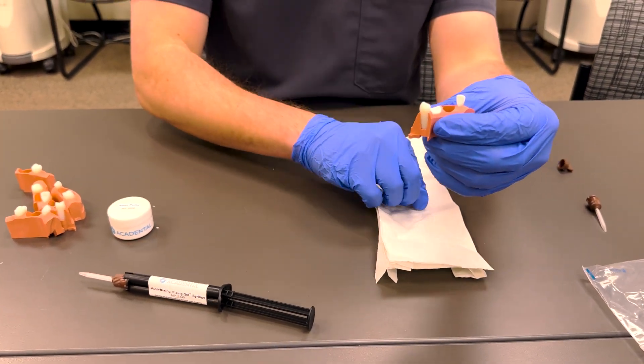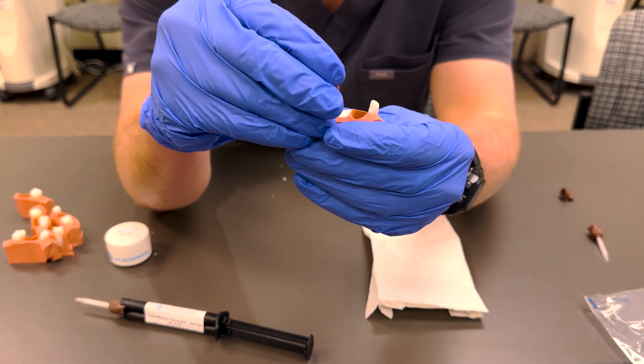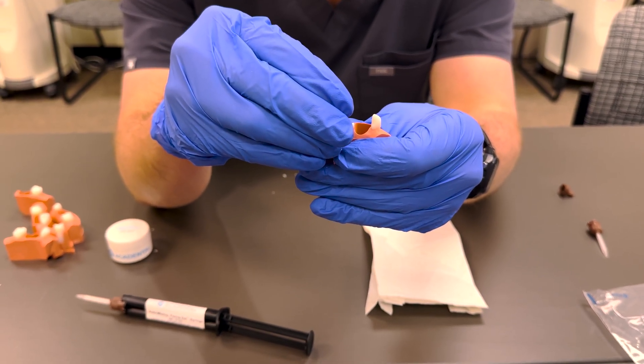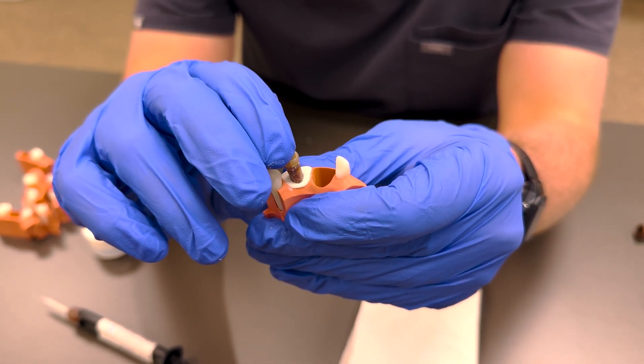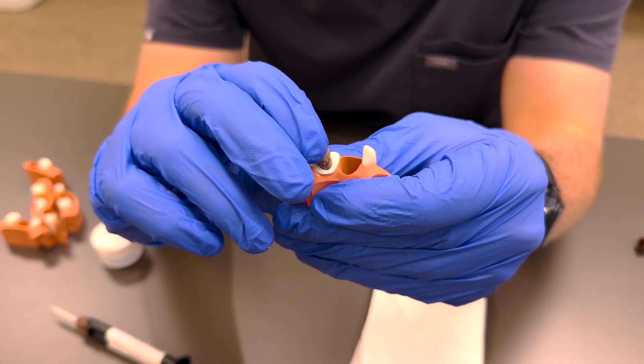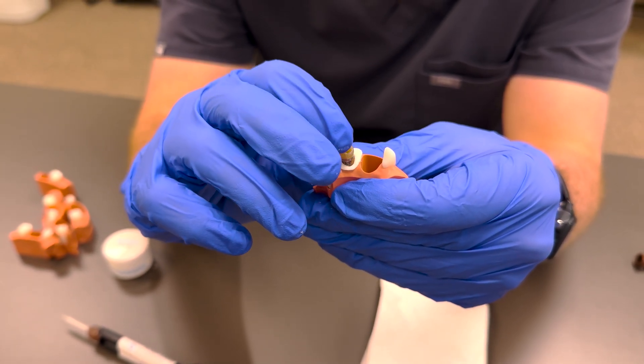From here, you're going to take your extracted tooth and place it into the apex putty. Try to center it a little bit and slowly push it down like this. Sometimes when the roots are longer it can be more difficult to get it all the way down, but try to set the occlusal plane similar to the adjacent teeth.